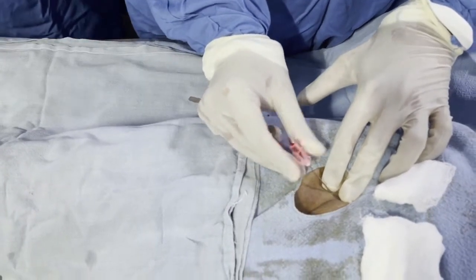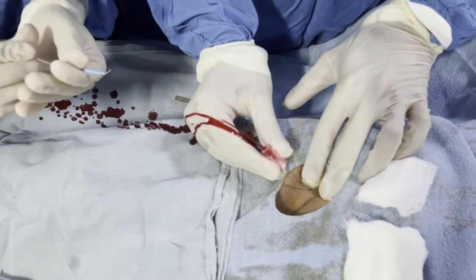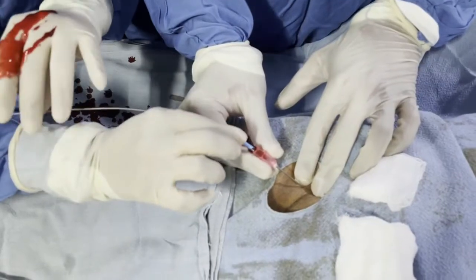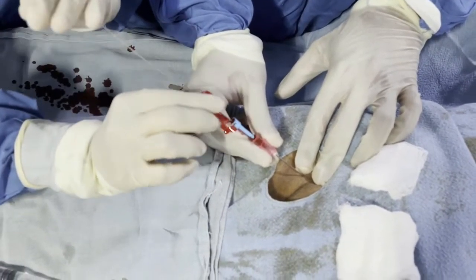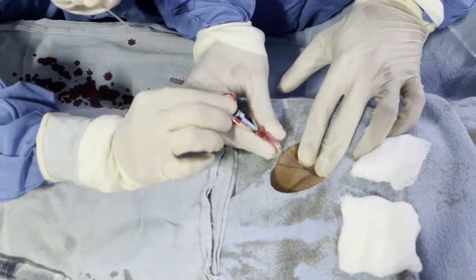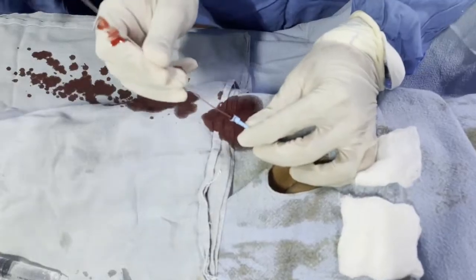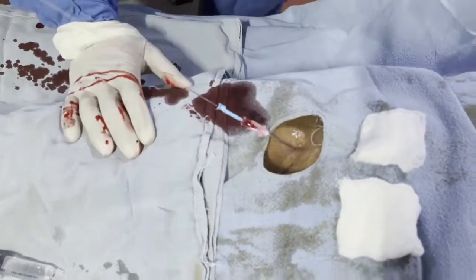With the puncture needle — 18 or 16 gauge — we inject into the femoral artery, directing towards the umbilicus at about 45 to 60 degrees. You could see the blood coming out as a gush. After that, we introduce the short guide wire into the puncture needle.